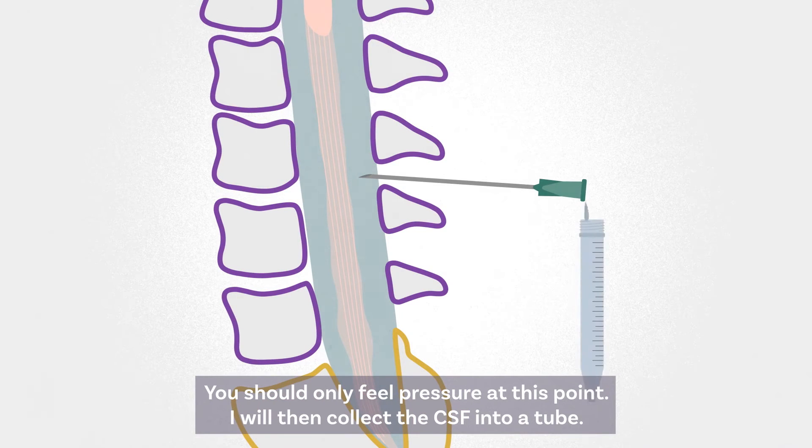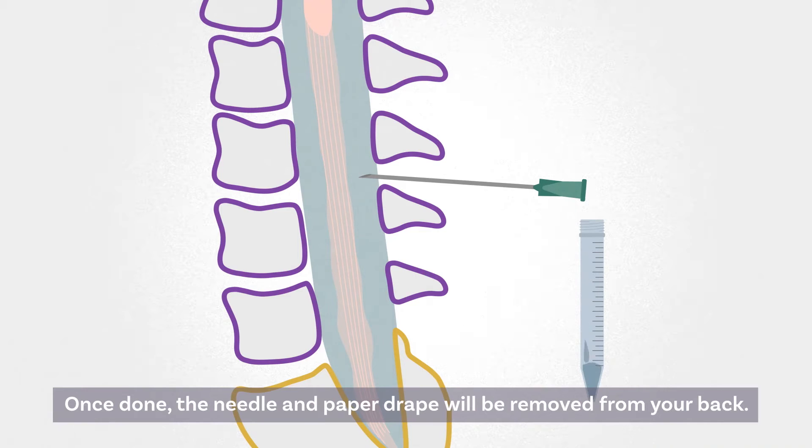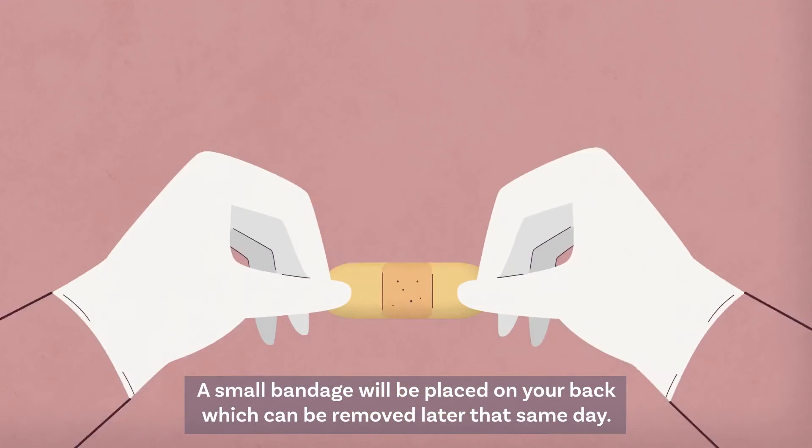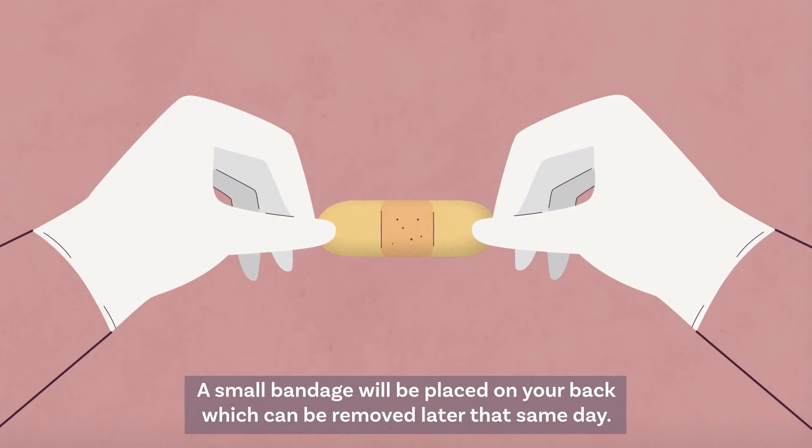I will then collect the CSF into a tube. Once done, the needle and paper drape will be removed from your back. A small bandage will be placed on your back, which can be removed later that same day.